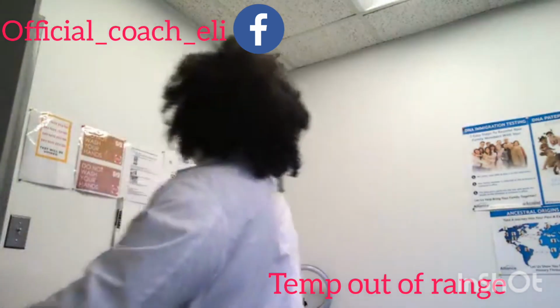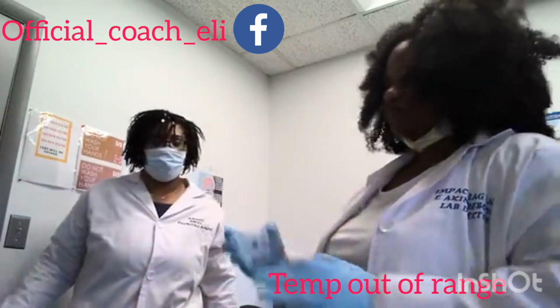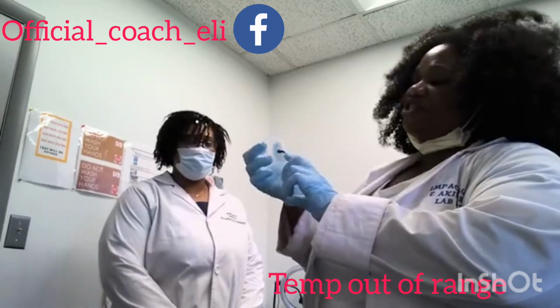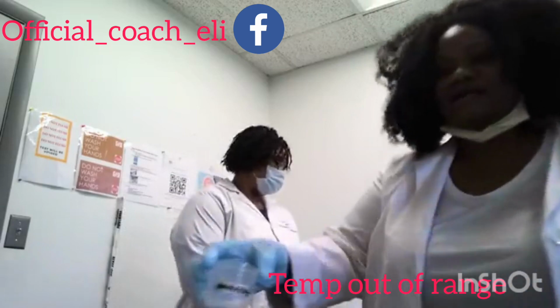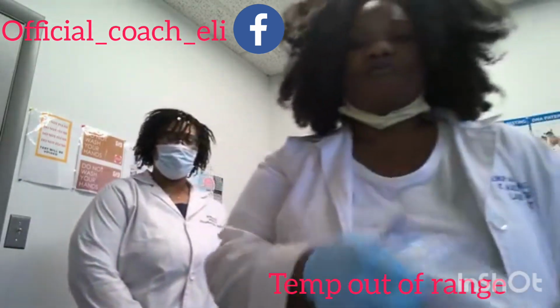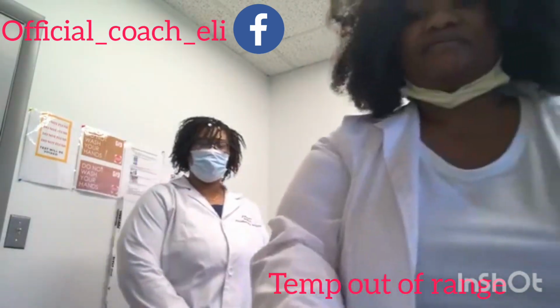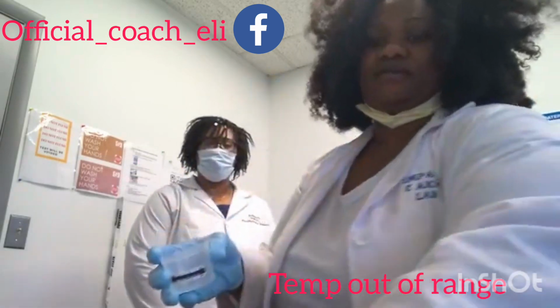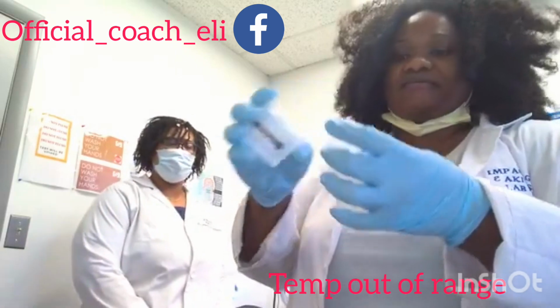All right, come on. Because I directly observed her, the temperature is now in range. So what I'll do is my split. I can actually go ahead and do my split collection. I'm going to pour 30 in this cup. All right, and I'm going to do another 15 here.